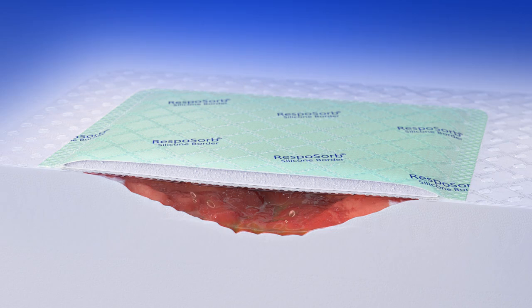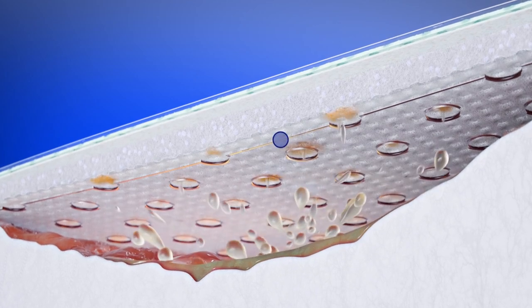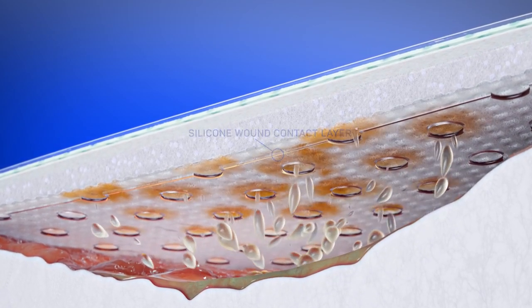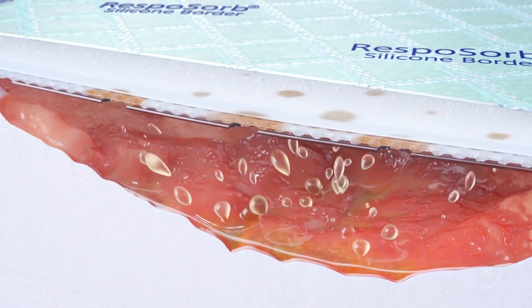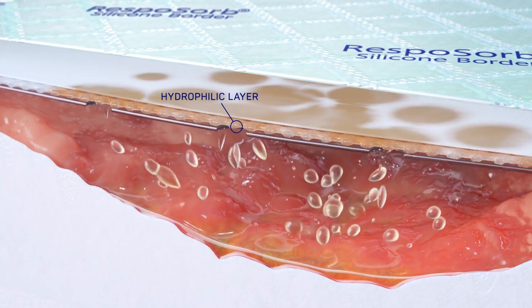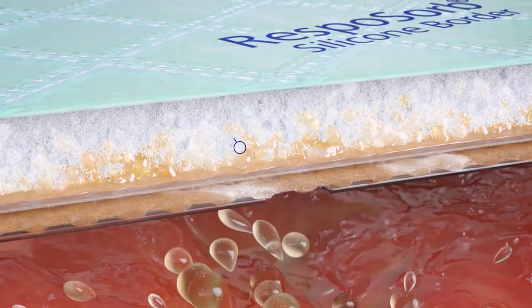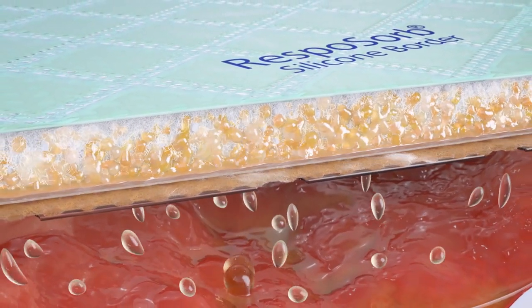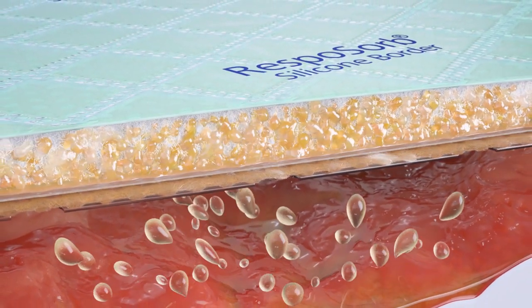Resposorb Silicon Border consists of five layers. The specially designed silicon wound contact layer balances adhesiveness and atraumatic removal. The hydrophilic layer allows quick transfer of excessive fluid into the soft polymer core with SAP, which distributes and securely locks away absorbed fluid by transforming it into a gel.